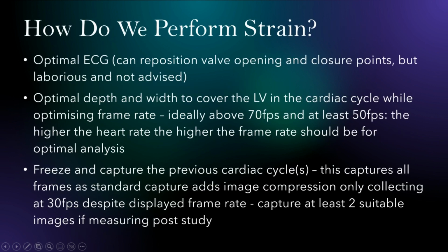So, in terms of how do we perform it, first thing we need to do is make sure the ECG is ideal. It uses it to pick those opening and closing points for the valve, so it can be manually adjusted, but it's a bit laborious, so I wouldn't actually advise going there, better to have a good ECG. You need to have an optimal depth and width.